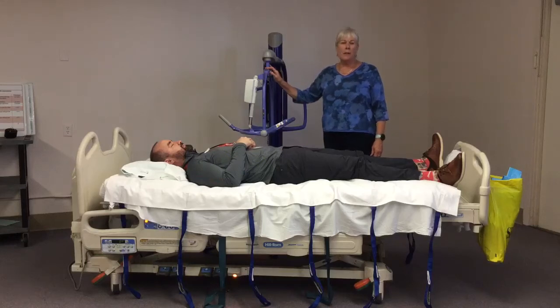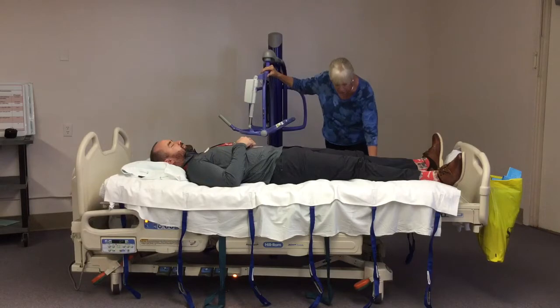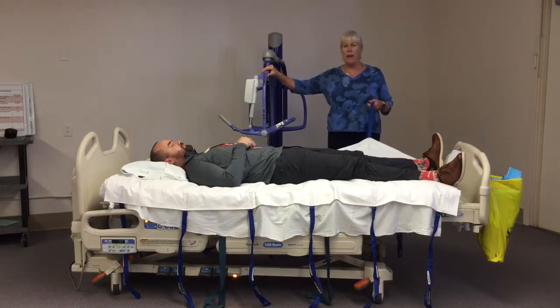Now we're going to talk about the repositioning sling that you use with the Maxi Move, with the 2-point spreader bar, or you can also use it with the Maxi Sky, and that's in the corner rooms in the East Towers. This loop sling goes up to 600 pounds, repositioning sling. It's disposable. It's actually made of a high quality paper, so it's not washable, and it's a single patient, multiple uses.